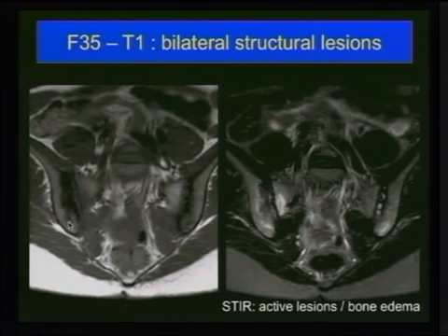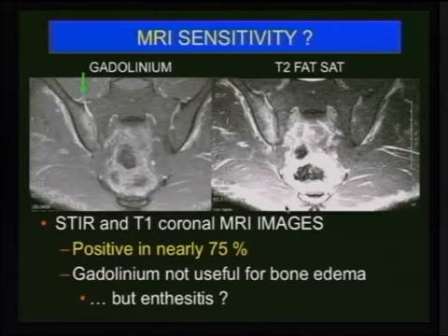But if you go this way, and you see this one, this is low signal intensity, but not the same degree as the bone. So this one is low signal. It became bright signal. This is edema. So this is acute on top of chronic, and this is an active disease. So this is not a burnt out disease.